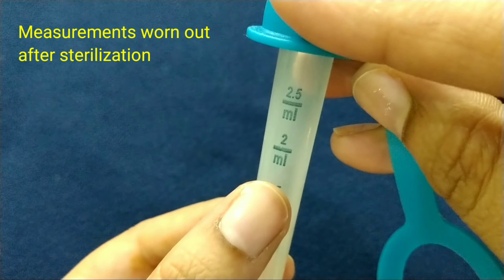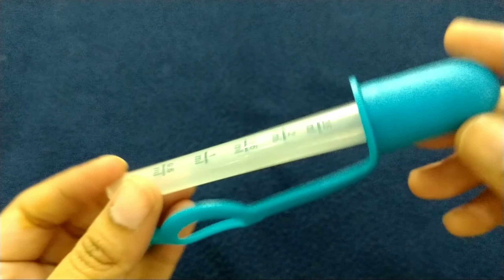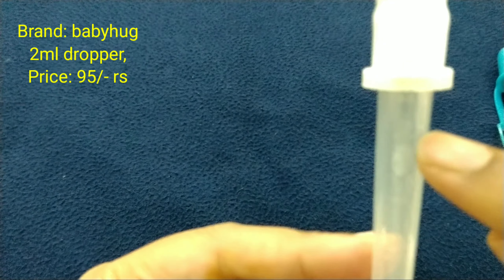The next is Baby Hug dropper. This is a 2 ml dropper. The price is Rs. 95.